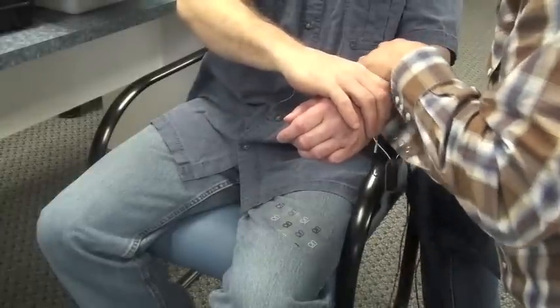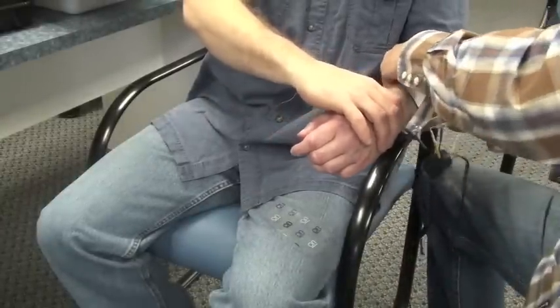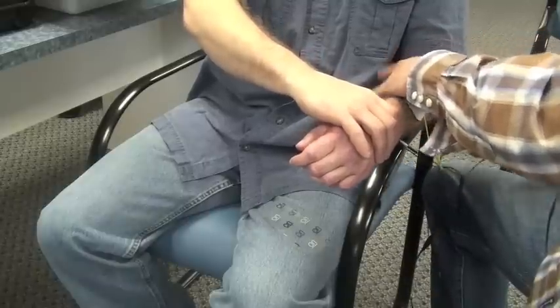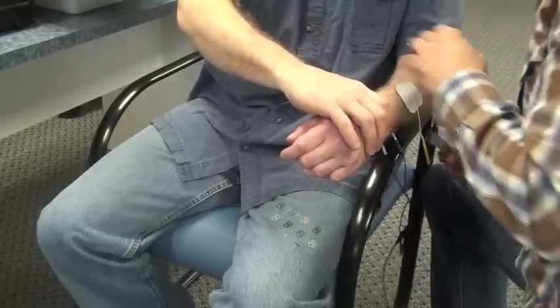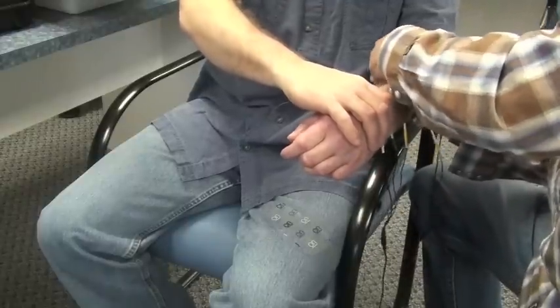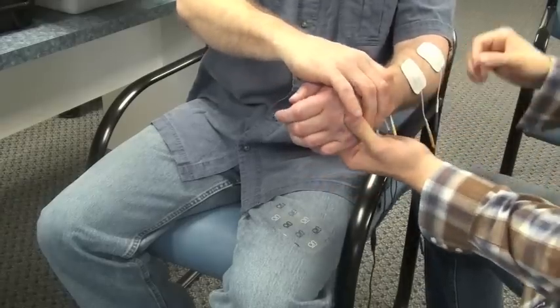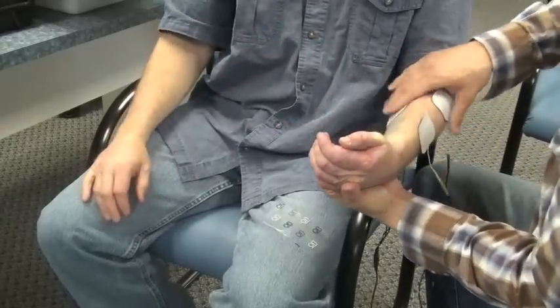Once you're happy with the electrical stimulation applied to the wrist and finger extensors, it's time to address the flexors. As a reminder, channel B is responsible for biofeedback. In this case, the wrist and finger flexors will be the biofeedback component, and you'll apply the three EMG electrodes to the flexors — there will be a blue, a yellow, and a black.